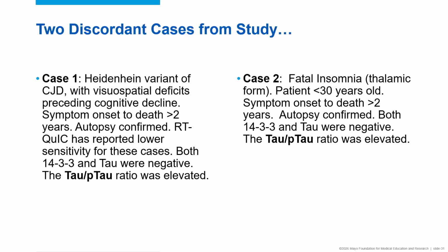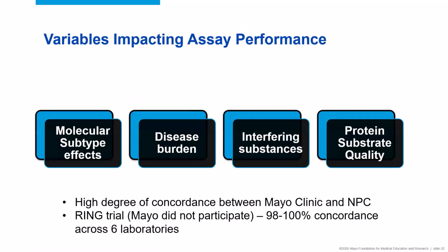The reason is, as I mentioned before, the recombinant protein is very critical, and there's always a concern that the test doesn't have perfect sensitivity nor perfect specificity. So given the importance of a diagnosis, if there is any question, we definitely recommend additional testing, and we will work with the clinician to coordinate to make sure that we get the appropriate result.